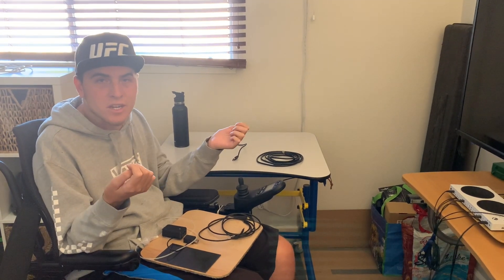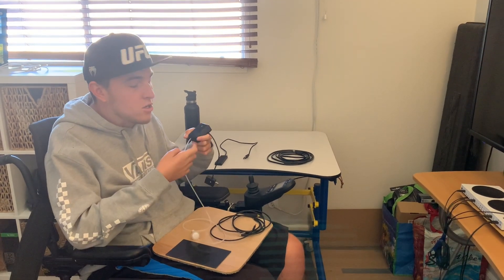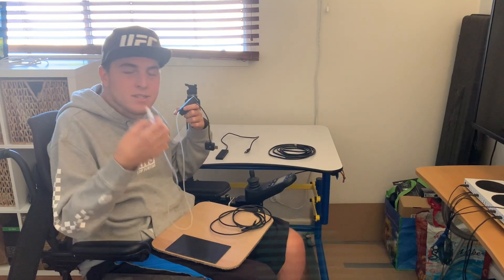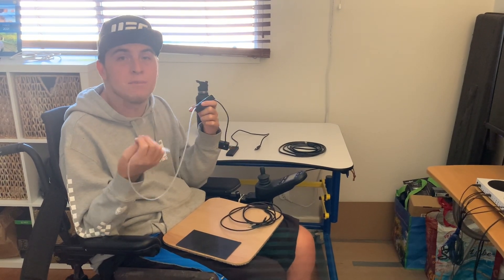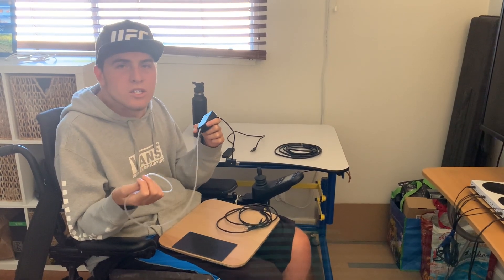I ended up purchasing this sip and puff device off a website. What it allows me to do is put this device in my mouth, and I can sip and puff, which gives me two different functions to use.